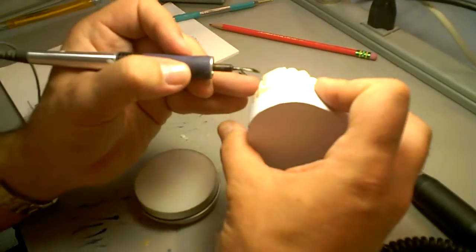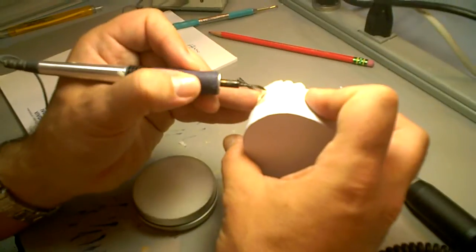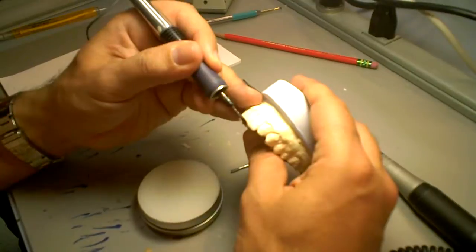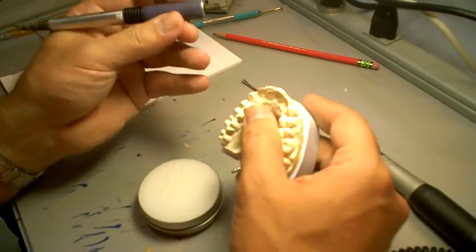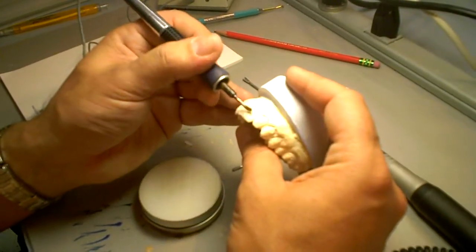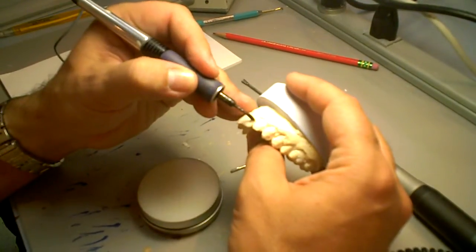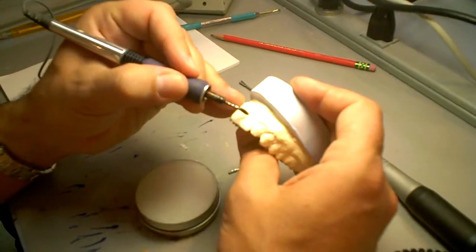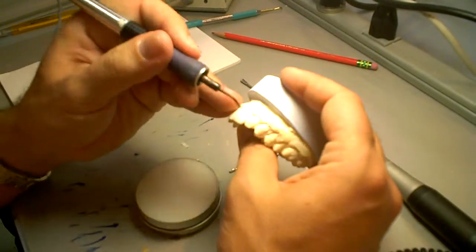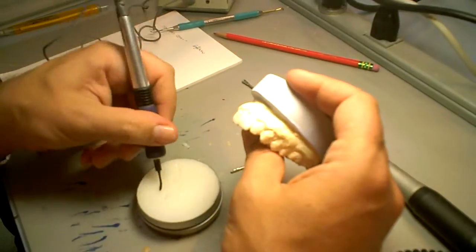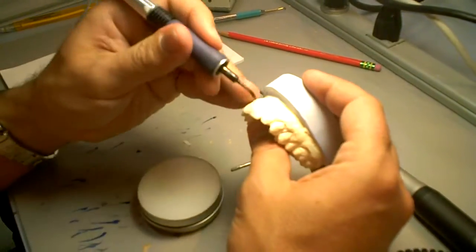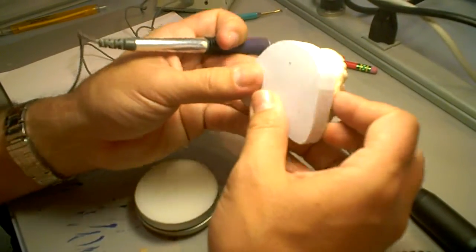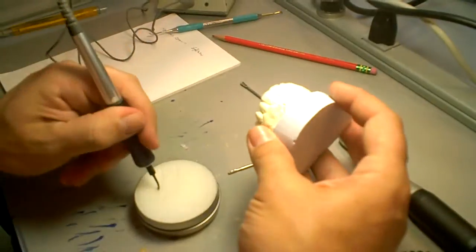At this point, if you find something like here that was under-reduced, just throw a little bit of wax in and fill that in. This is a diagnostic wax-up, and it's just a tool for our provisionals. Now that we're talking about provisionals and tools, we're going to do not only a stent for provisionals, but we're going to do a second stent as a preparation guide. So you can put that on top of those teeth and just prep properly. So again, I'm going to look at it from this side, this side, and my profile, always.